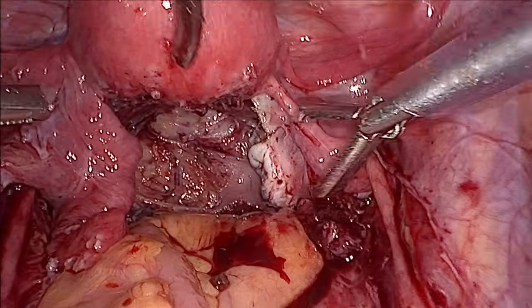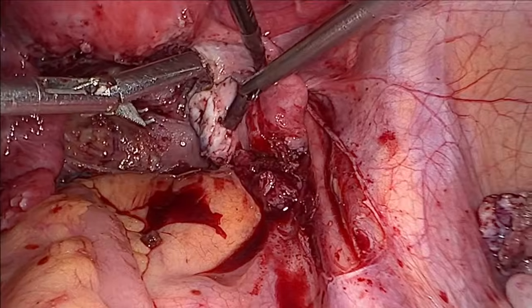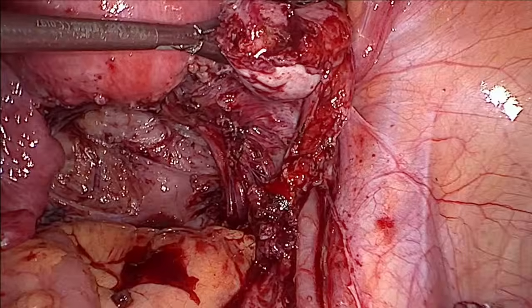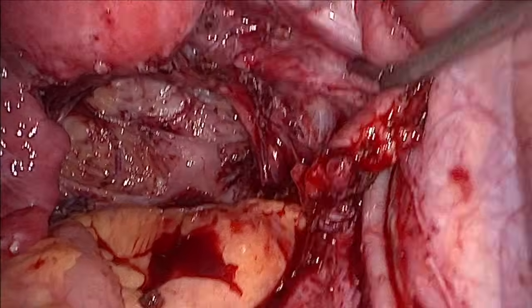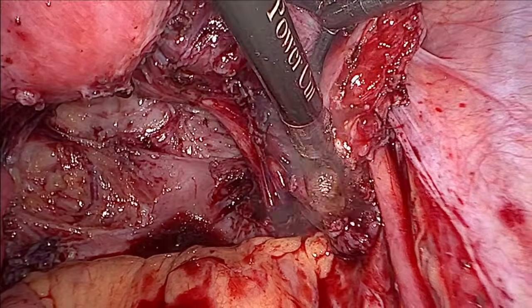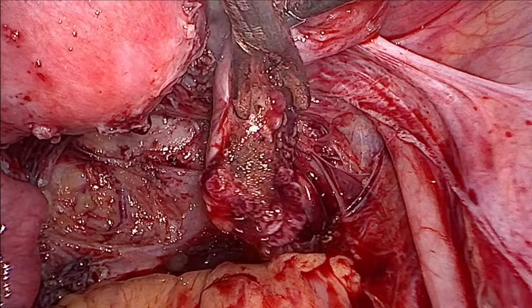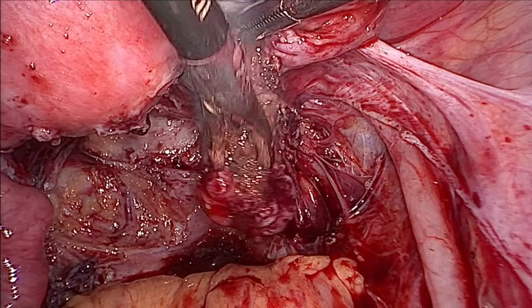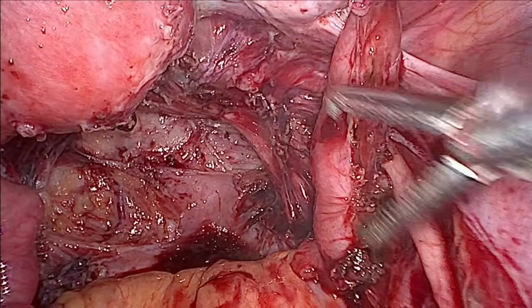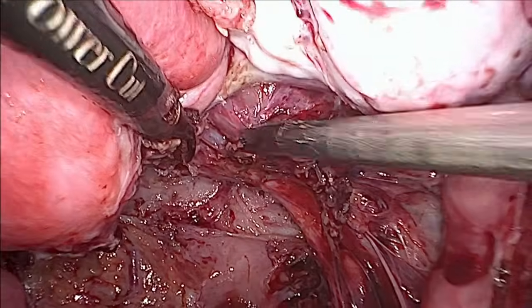Okay, which side? Yeah, I want to check it. Yes, you can hold and lift it up. Yes, thank you. Okay. Everything seems to be okay. Adhesion is released off.